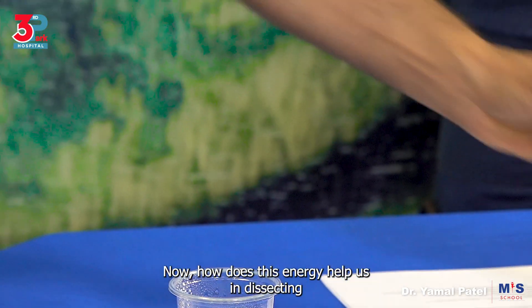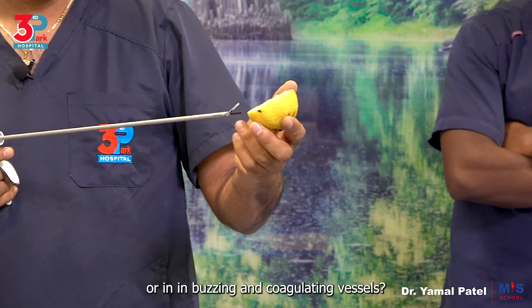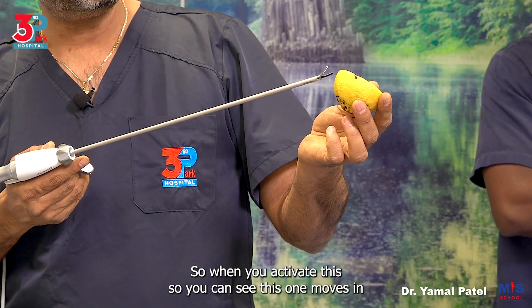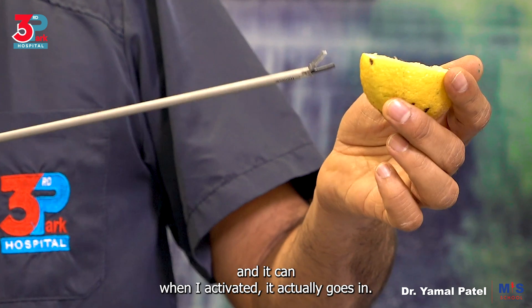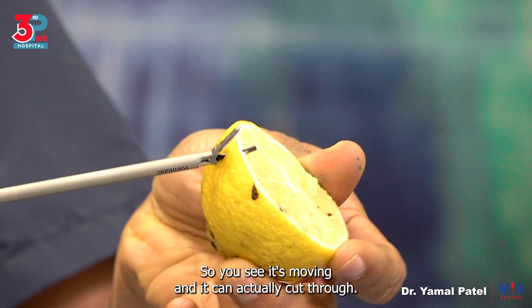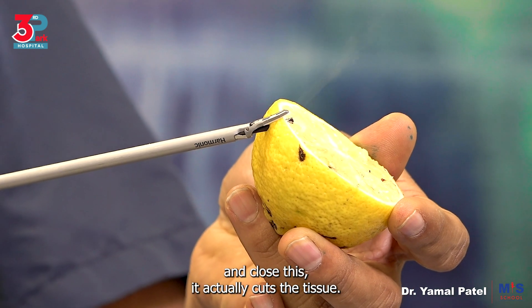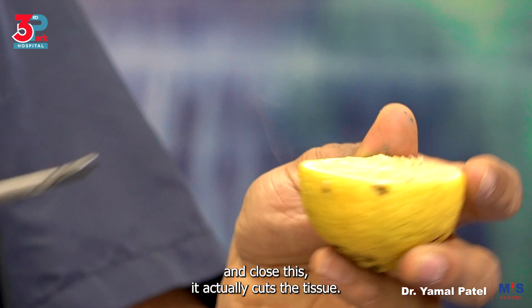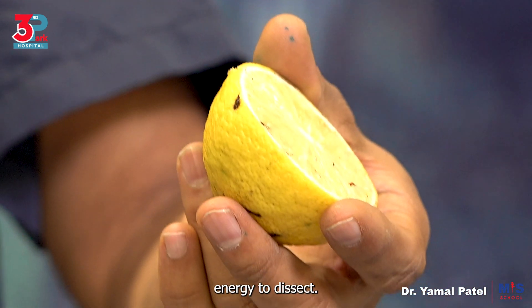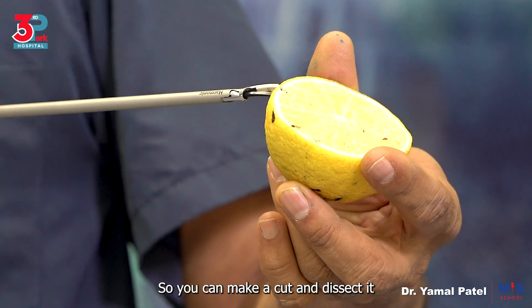How does this energy help us in dissecting, buzzing, and coagulating vessels? When you activate this, you can see this one moves in and when I activate it, it actually goes in. You can see it's moving and it can actually cut through. When I put it in and I activate it and close it, it actually cuts the tissue. So this is how you would use this energy to dissect — you can make a cut and dissect it off.